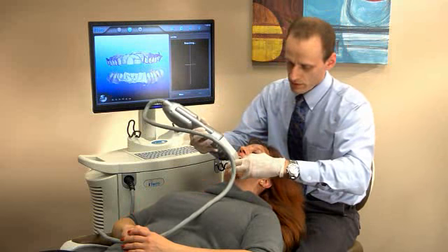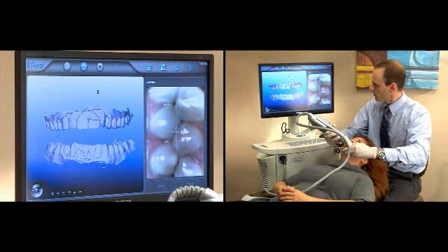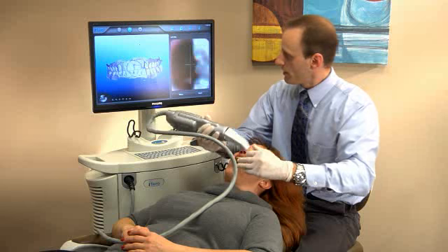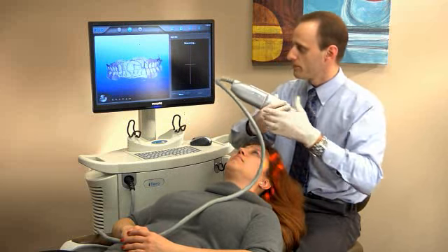Open, close. Now I scan the bite anywhere on the left side, showing an even amount of the upper and lower. I want to make sure that the arches come into occlusion. Open up. Everything looks good. I'll continue to the right side by pressing menu, clicking OK.